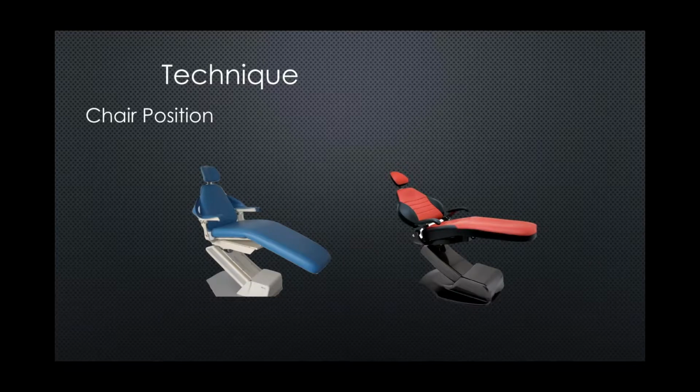That's chair position. Now, vertical chair position. So typically we say that if you're taking an upper tooth out, raise the chair up enough so maybe the patient's jaw is at your shoulder, maybe a couple inches below your shoulder joint. And if it's a mandibular tooth, position the patient's chair superior-inferiorly based upon maybe your elbow. So you want to be around your elbow. So just be comfortable. It's very, very important that you are comfortable.